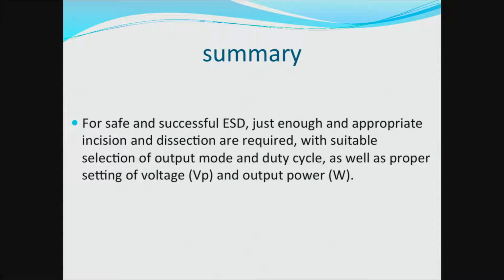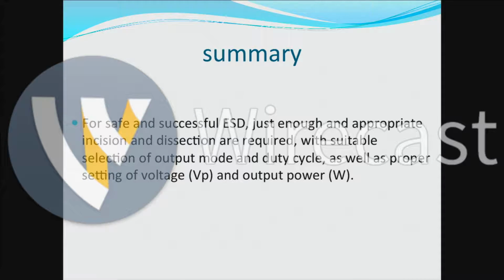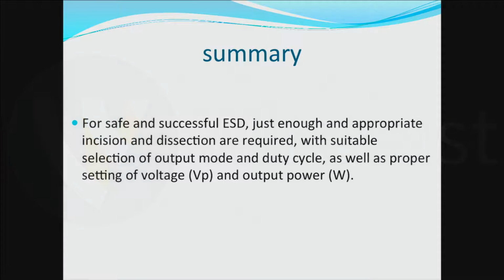But even the cut itself has some coagulation. So the difference is which result is required, cutting or coagulation, in a different situation, fibrotic tissue or not fibrotic tissue, something like that. I have some comment. How to choose the coagulation mode sometimes depends on the doctors.